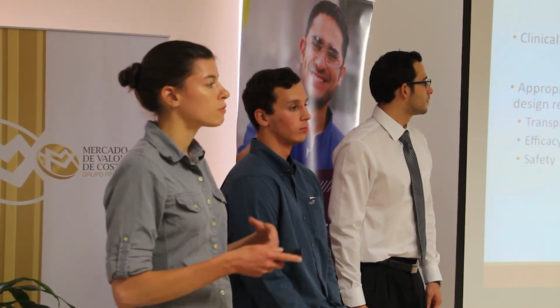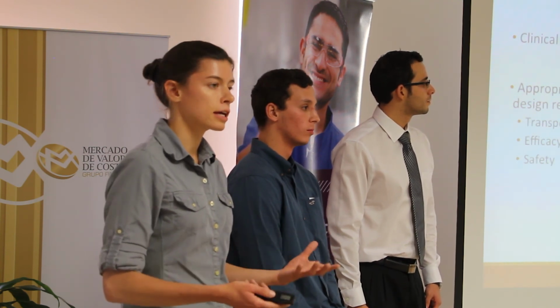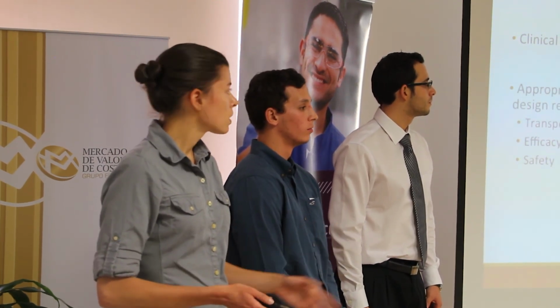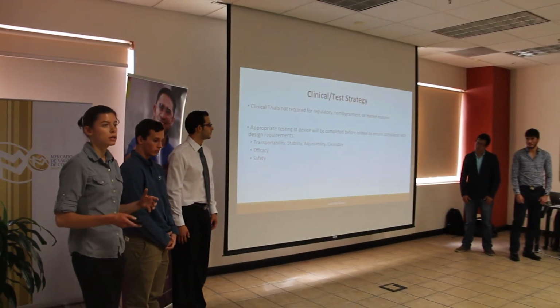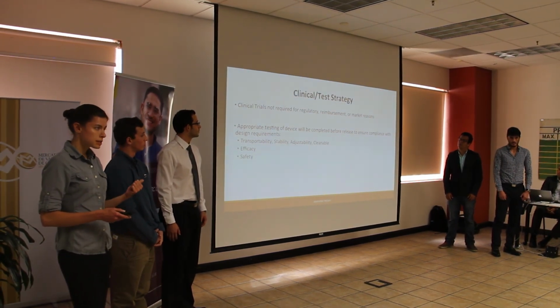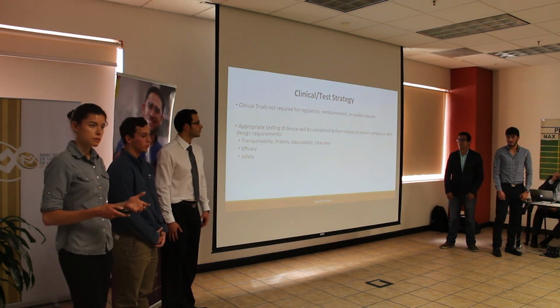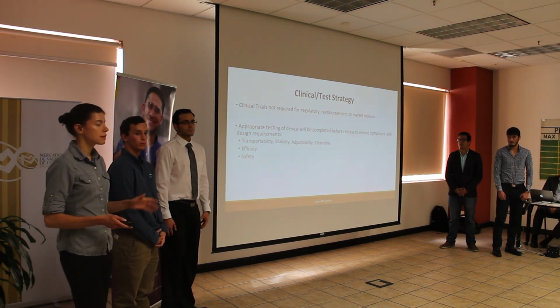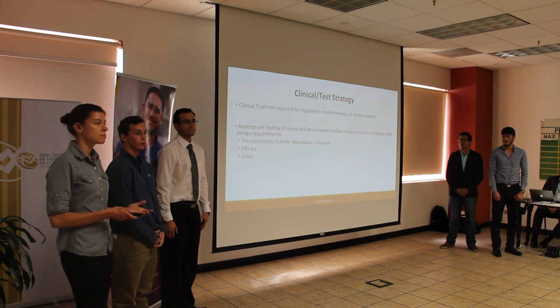These tests will be for our customer requirements. We need to make sure that it is easily transportable, since sometimes these people need to move it long distances from the hospital where they're likely to get it to their homes. It needs to be stable, it needs to be adjustable, and it needs to be cleanable in case something happens. It also needs to be tested for efficacy, or usefulness, and safety. We need to make sure it performs as it's supposed to, and since many of these patients have large families, make sure it's safe for both the patient and the patient's family.